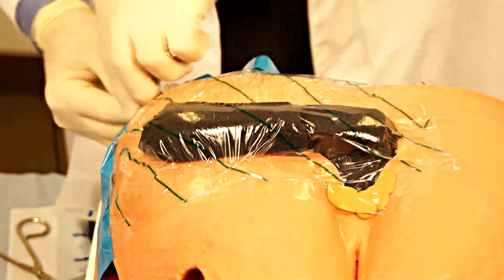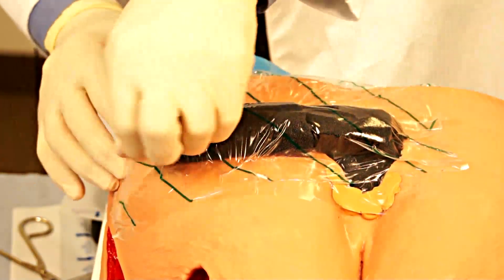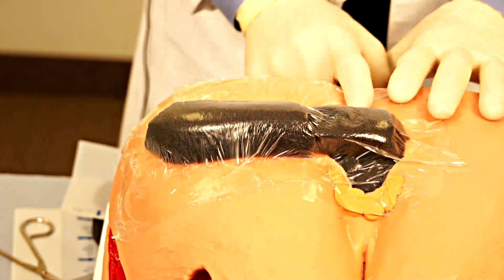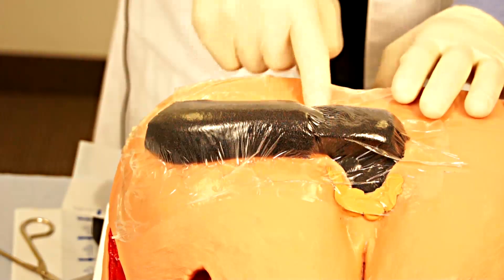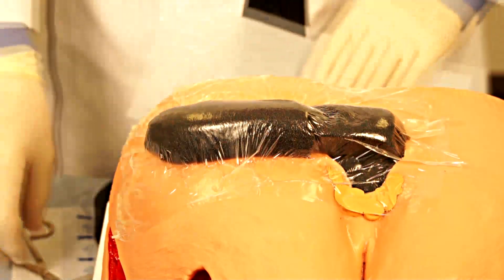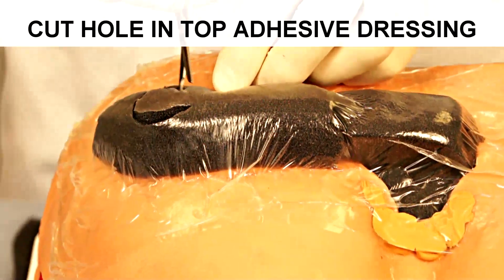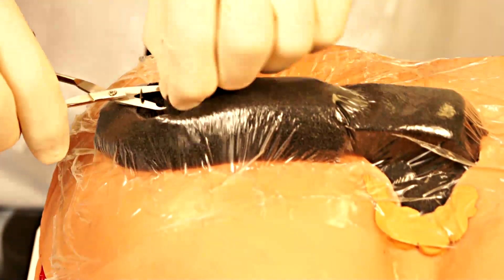Once you have entirely sealed this second layer of your foam dressing, you are now ready to peel this off. You have now constructed a bridge that extends from over your primary dressing — where you've cut a hole in the sealant covering the sponge filling the wound — and this is now on top of adhesive, not in contact with normal skin, extending out to where you would like to position your tubing. Similarly, as done over the wound dressing, cut a portion of the adhesive away. If you remove a portion of the sponge with this, it's not a problem, so feel free to carve as needed with your scissors. Discard that.